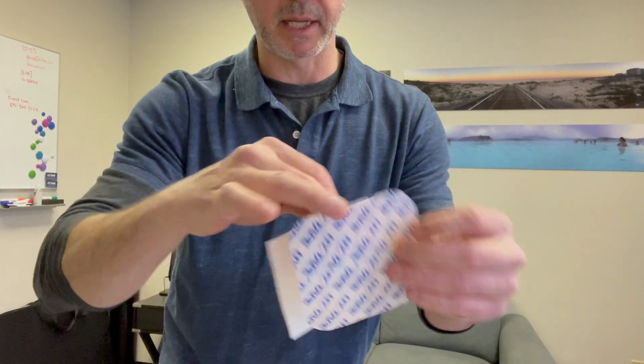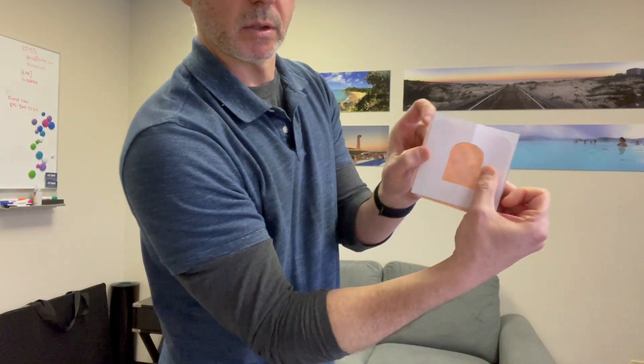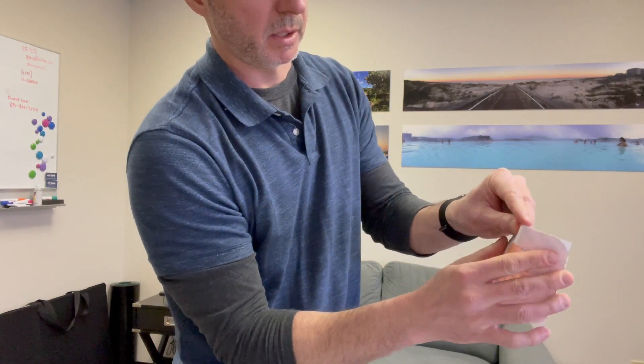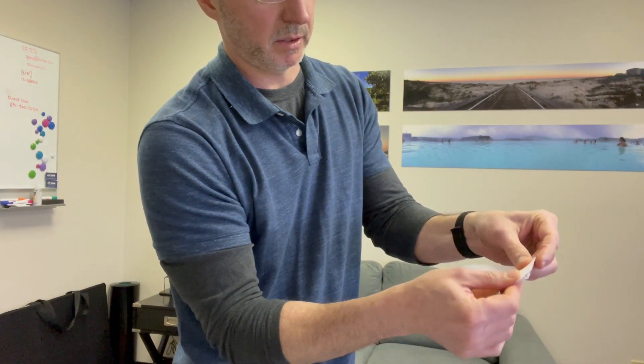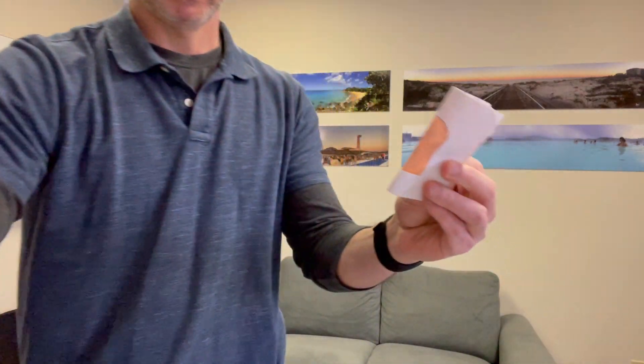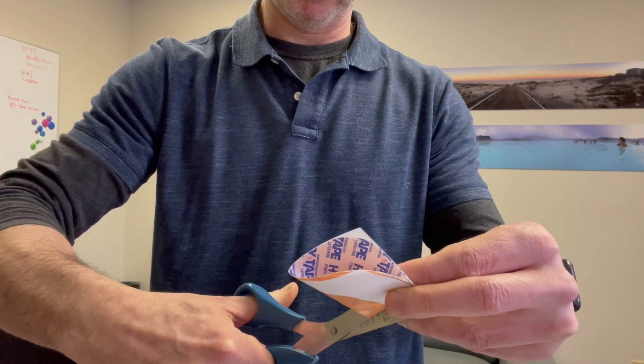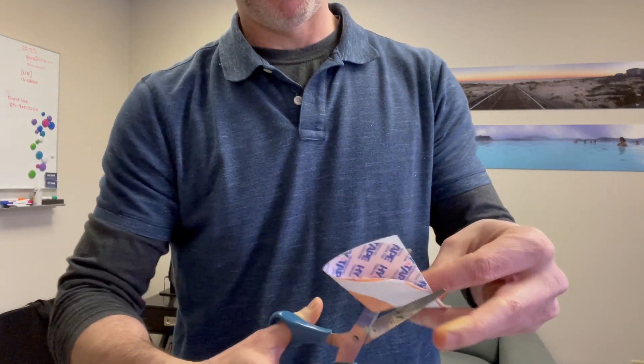You see how the tape comes apart like that — I fold it just like this. If it's over the top, fold it in half like so, and then just cut the shape out of the material.